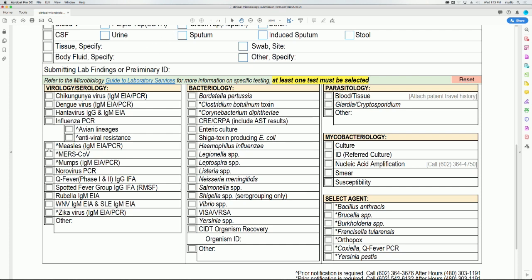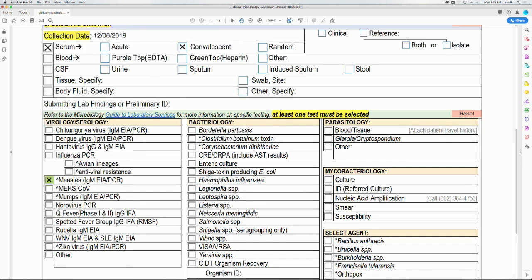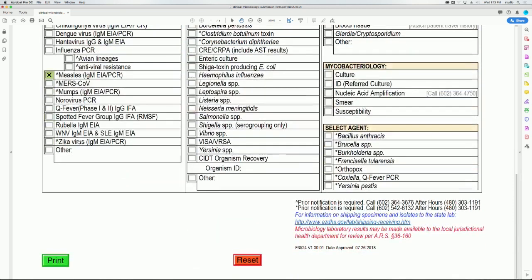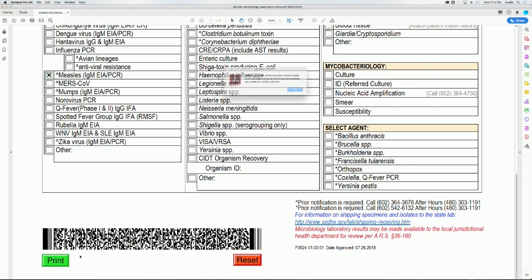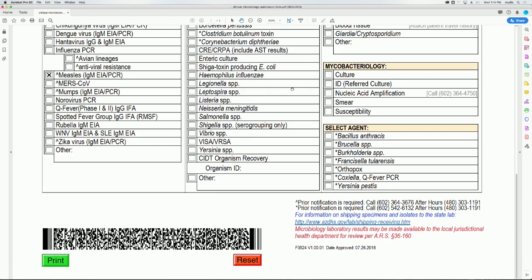Once all required information is filled out, click on the green print button at the lower left corner of the form. This will generate a barcode and your submission form will be ready to print. If you try to print using the printer icon in Adobe, you will get an error message. Please use the green print button as the form will not print without a barcode.